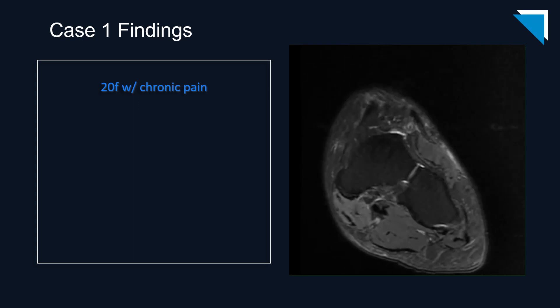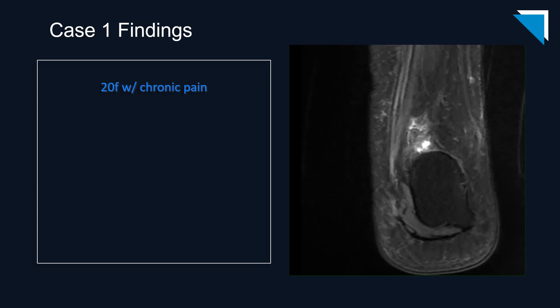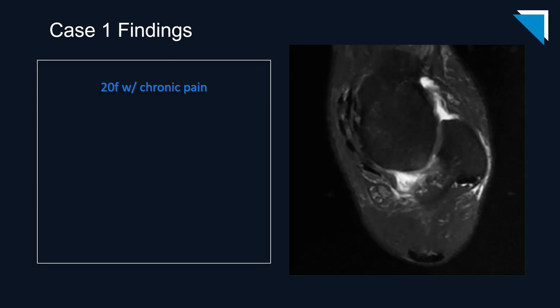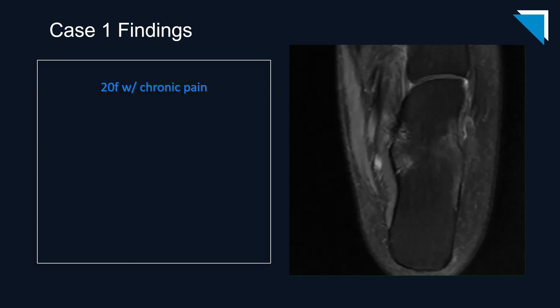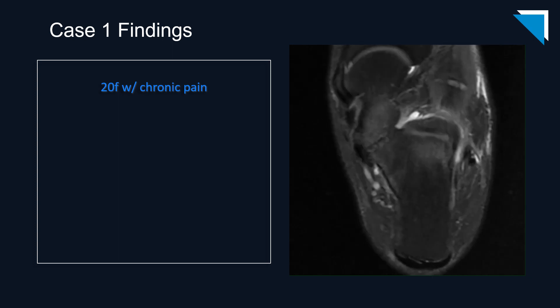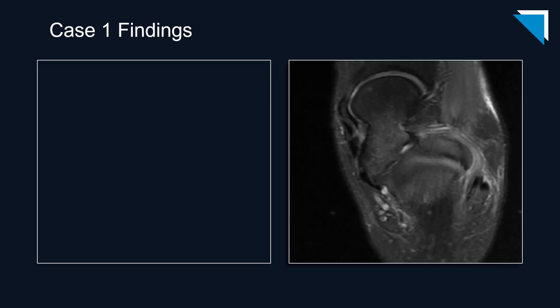Remember to pause the video if there is a particular image you want to scrutinize. Let's scroll through the fluid-sensitive axial images. This is a single image from the axial fluid-sensitive sequence which demonstrates patchy periarticular bone marrow edema, as well as irregular narrowing and subtle sclerosis of the middle subtalar joint.